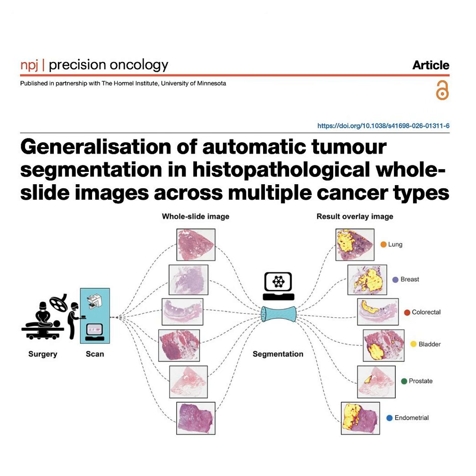Here's where it gets really interesting for you listening. Think of this tiling mechanism like mapping the world using satellite photography. Oh, perfect analogy. Right. You cannot process a high-resolution picture of the entire globe at once and expect to spot a specific cluster of pine trees in Canada. You crash the computer. Exactly. So you analyze a 10-mile grid, you identify a forest, then you move to the next overlapping grid, identify a river, and then you digitally stitch all those individual grids together to make a seamless map. That is exactly how the neural network approaches the tissue.